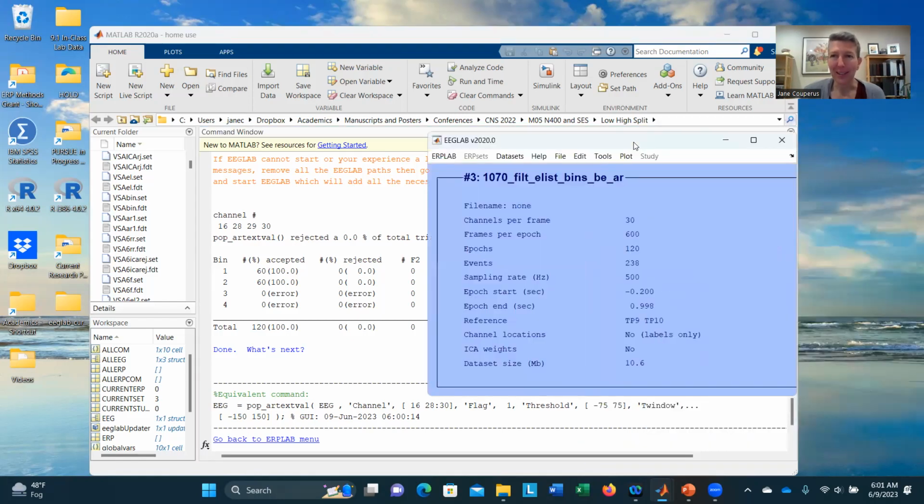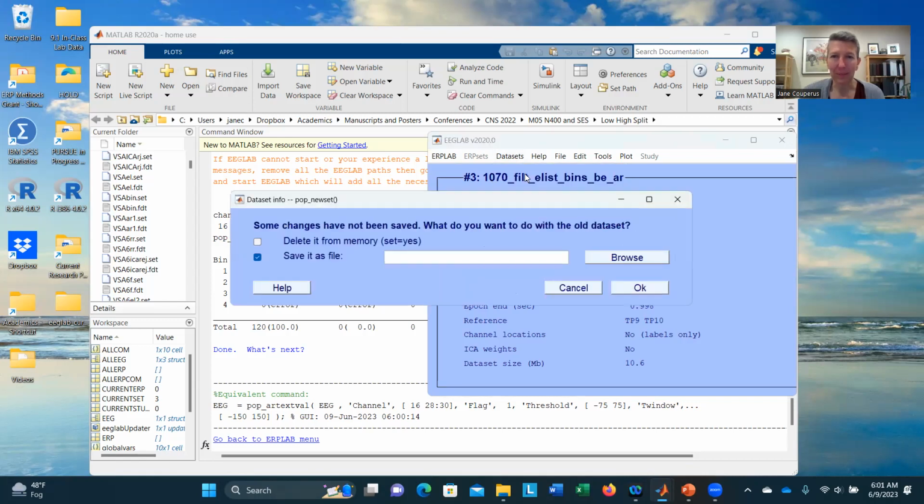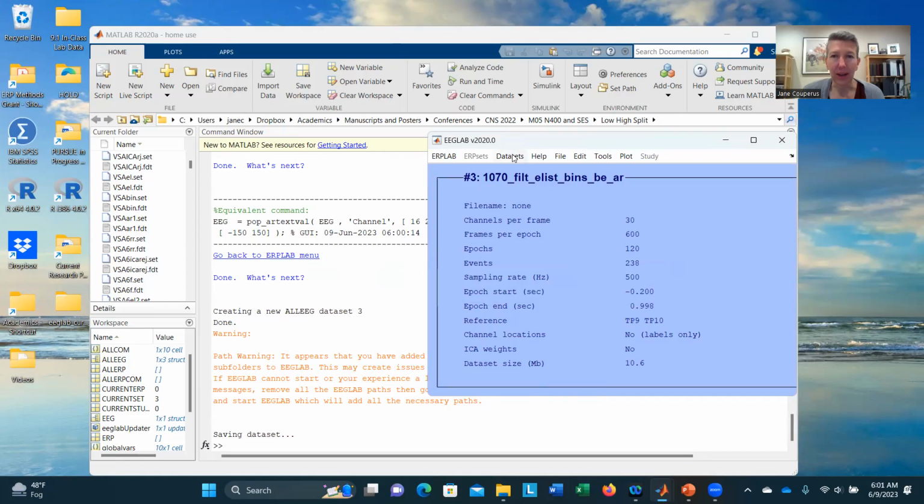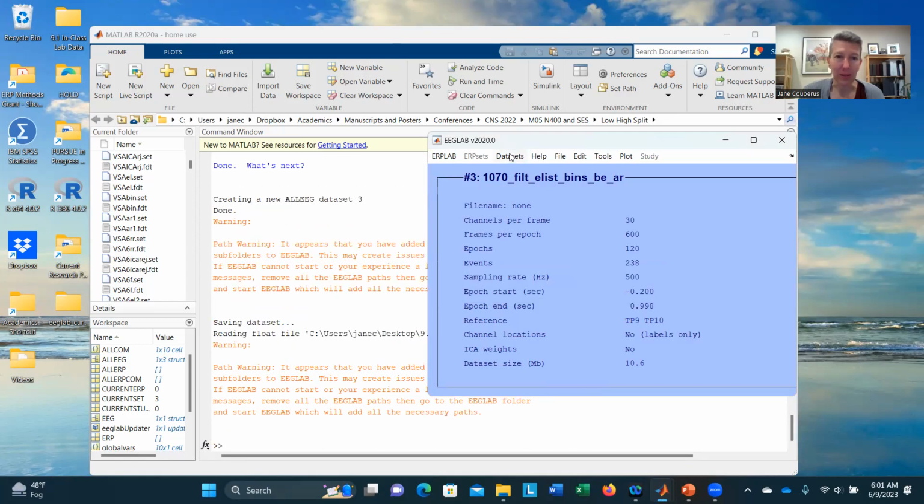Probably there are some other artifacts in there I care about, so I'm going to show you what would happen if I did a moving window peak to peak instead, and I changed some of those parameters. So I'm going to go back, and it, again, is going to ask me to save it because I'm moving away from the data set I was on. And I'm going to mark this with a 2 because it's the second one I did, just so that I know it's the second one. And again, once it finishes, I'm back on data set 1.